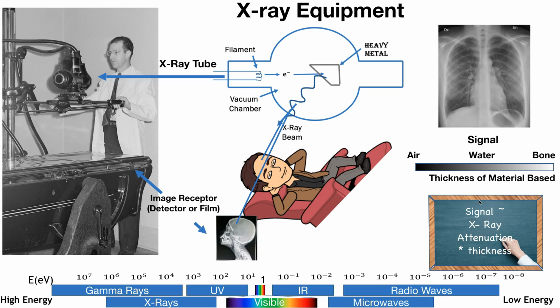So in x-ray imaging, we see everything in that ray path. All the anatomy is overlapping in what we can call a shadowgram, for instance, as the x-rays pass through that anatomy. So this is a chest x-ray image. You can see you have the heart, the spine, the ribs, all this anatomy is overlapping.